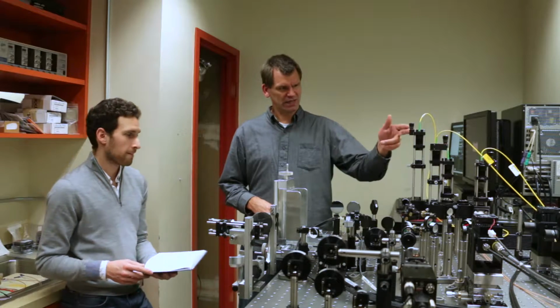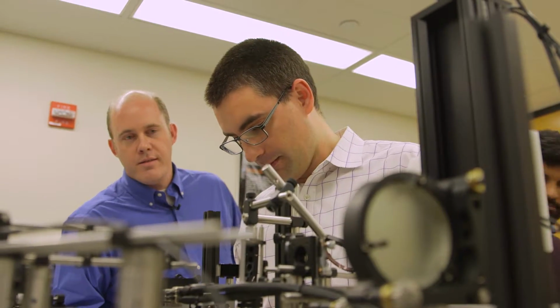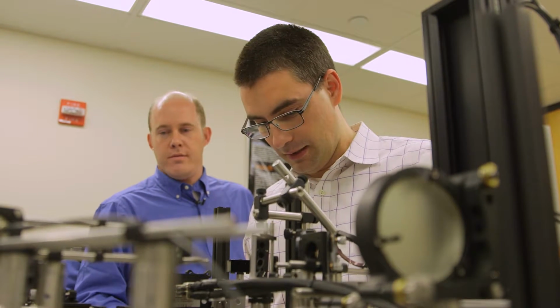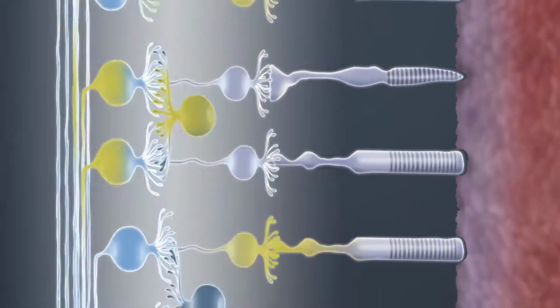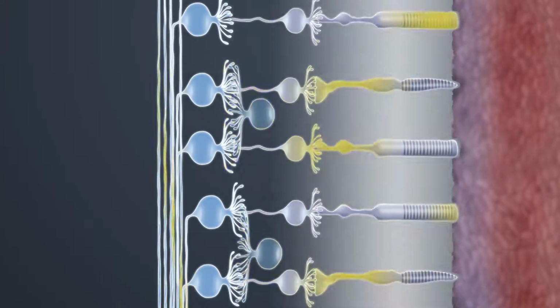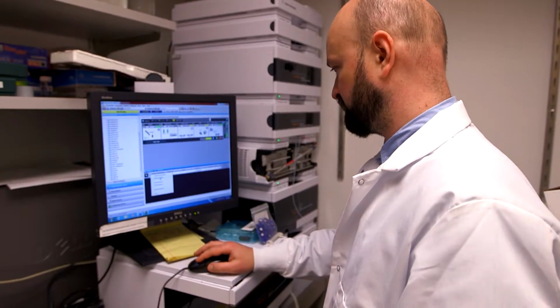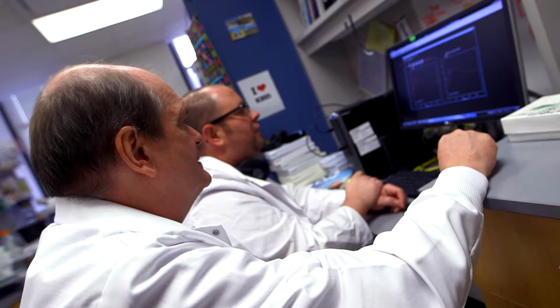Several researchers supported by the NEI Audacious Goals initiative are pushing the boundaries of retinal imaging to get a better view. Beyond anatomical detail of the retina, researchers also want to be able to see when cells are functioning properly. That includes biochemical functions inside photoreceptors. Those are like the engine in the car. This is the most critical part of the retina that is responsible for capturing the light and responding to it, translating the physical stimuli into biochemical language.